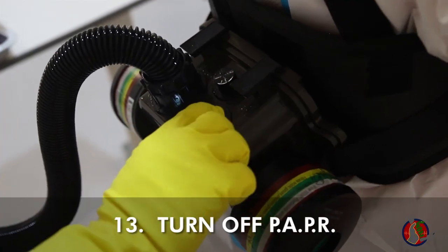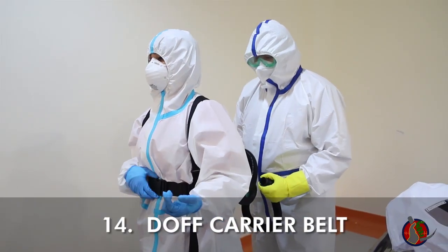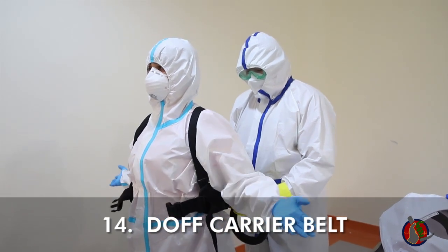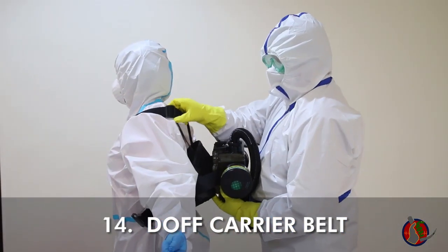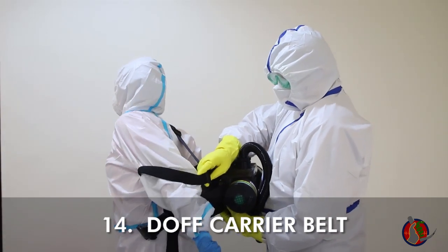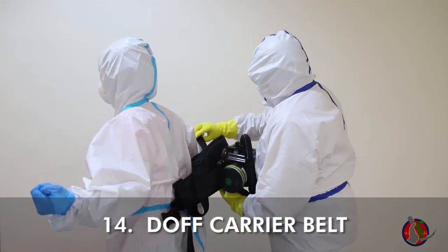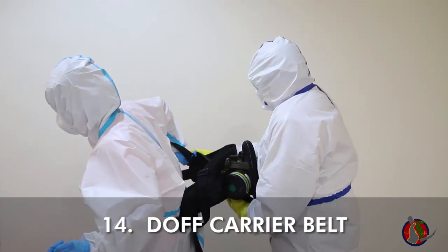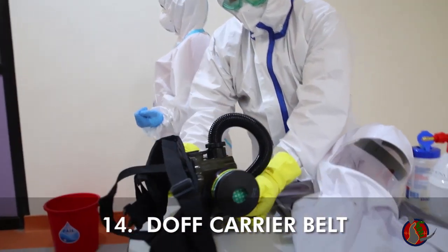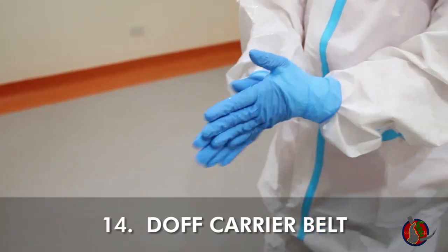Turn off the PAPR. With your buddy standing behind you and holding the PAPR body, unclasp the belt and remove the carrier away from the body. Make sure your buddy is holding on to it. Do hand hygiene.